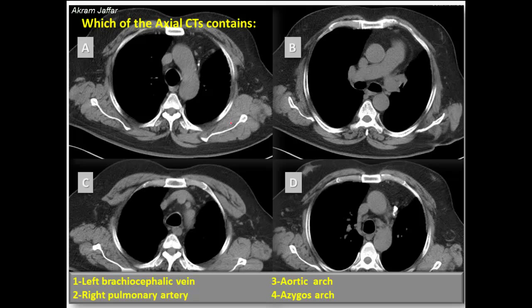Which of the axial CTs contains the left brachiocephalic vein, right pulmonary artery, aortic arch, and the azygous arch?